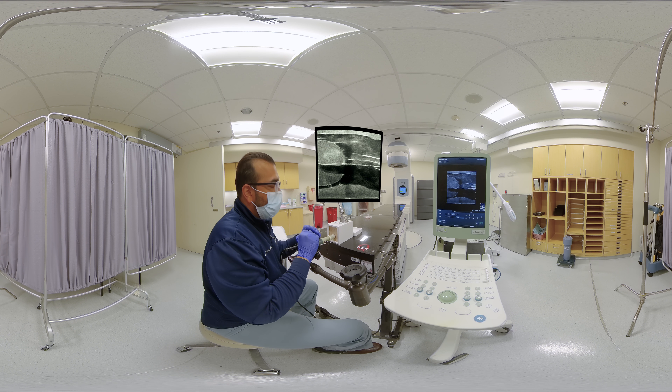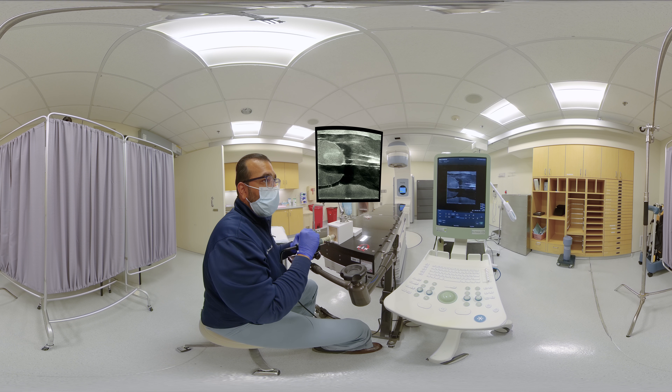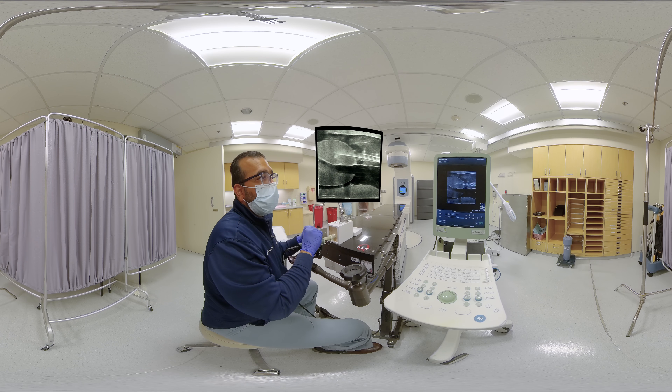To review the skills we've discussed so far: this is inserting, advancing, and retracting the needle. This is sweeping across the sagittal plane to find the needle tip. If a needle has a steep angle or is pointing down, you can retract and make it more parallel to the probe angle. Another key skill is finding the beveled edge. In this example, the beveled edge is pointing down — we see this here. If we need to change the direction of the beveled edge, we can rotate the needle and now it is pointing up. This is important for transperineal placement of rectal spacers and can be helpful for directing a biopsy gun and transperineal prostate needle biopsy.